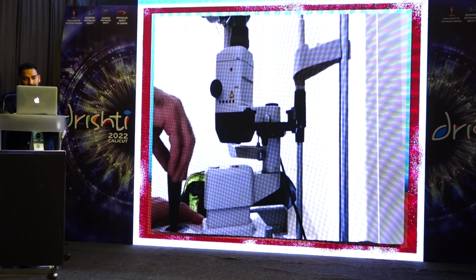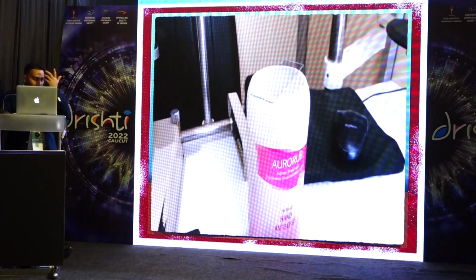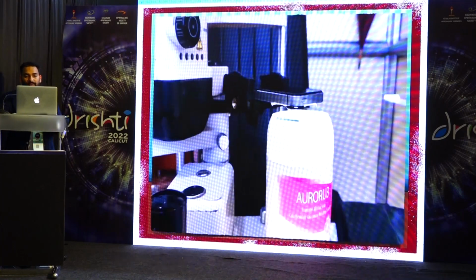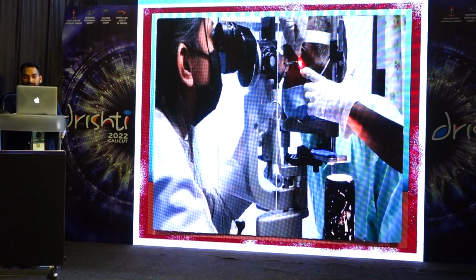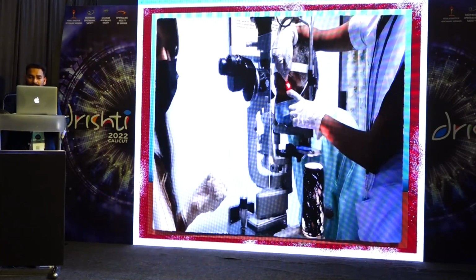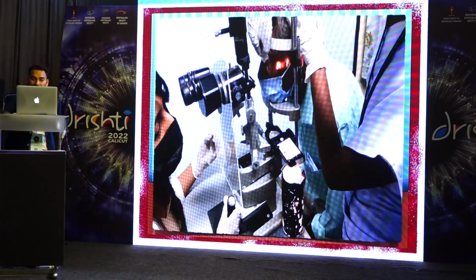This is an attachment to the slit lamp. It will move with the joystick, and this is the attachment of the smartphone to the slit lamp. Now you can either keep an illumination torch from a phone or a handheld torch. You can take corneal scrapings and see for fungus right there at the OPD itself. With the attachment of the slit lamp, it becomes easier. The phone doesn't shake. You can use it to go around the whole field of the sample. Here there's a demo showing the same, and then you can just check for fungal hyphae.